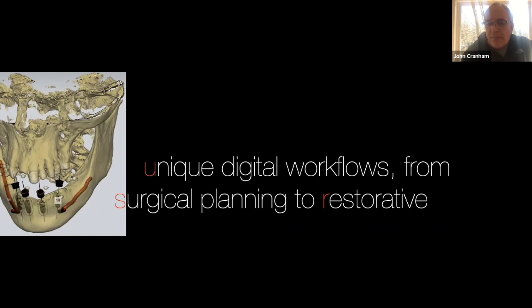We had a couple people ask that. So, Don, if you wanted to do your reline material with HydroCast, you could do that and then send it to the lab and they could reline it. But it's funny because we're still struggling. We're here, but our minds tend to go back here. Literally, it's just as easy and probably a lot less labor if you just do a wash impression, scan it like John does, and send it to the lab.